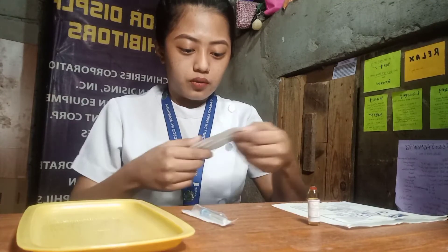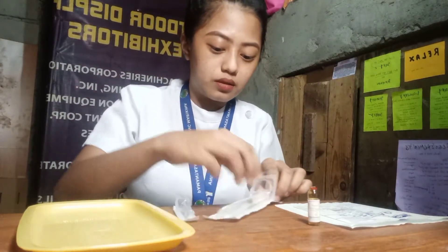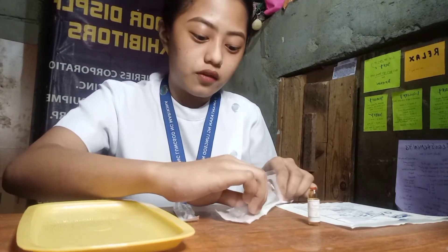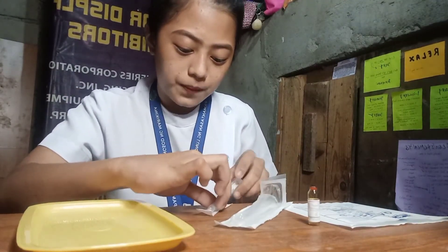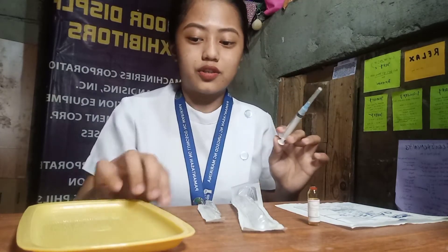After we break the ampule, we need now to withdraw the medication. But before we do that, we need first to set up the syringe. We need to get the syringe and the aspirating needle, remove the original needle of the syringe, and then insert the aspirating needle. We've already changed the needle, but we will be needing the original needle later, so let's set it aside.